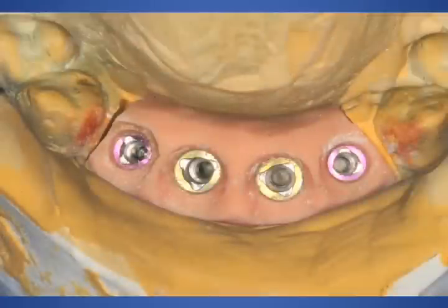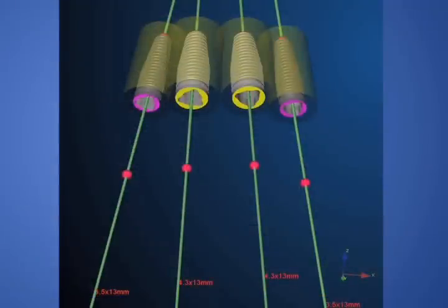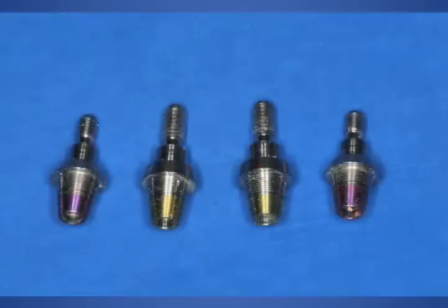After the CAT scan was completed and the Nobel Guide CT scanning software was used, the dental laboratory actually fabricated a model. Again, this is prior to me ever touching the patient, to determine the correct or ideal position of the dental implants. Again, 3.5 millimeter Replace implants in the lateral incisor areas, and 4.3 Replace Select implants in the 2 central incisor areas. This is all done preoperatively by our dental laboratory.